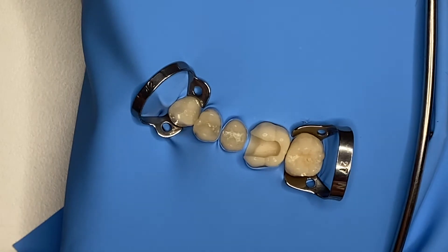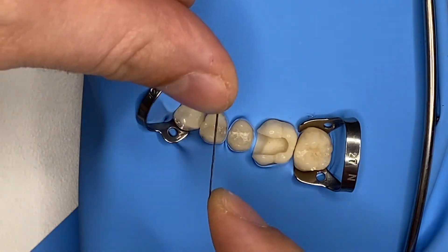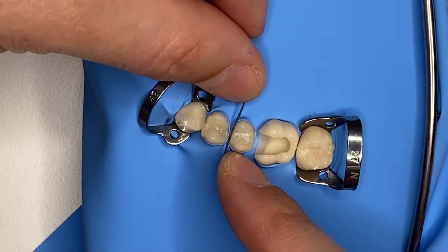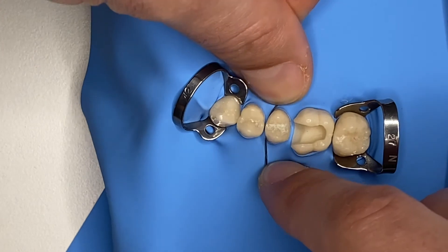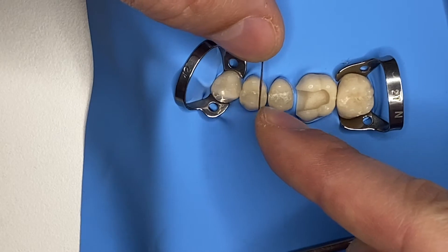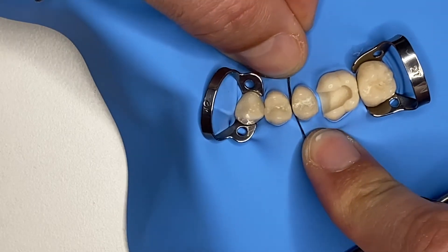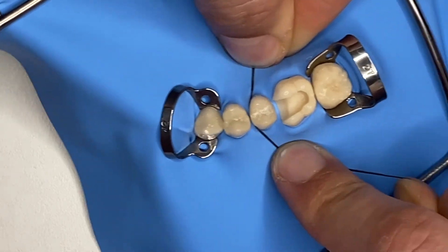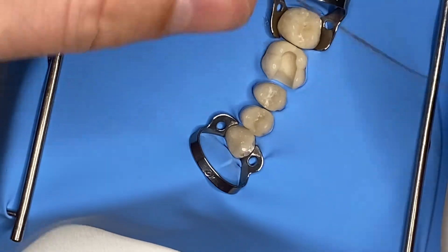For example, between my two premolars, you can see that the rubber dam is caught — this is a thick rubber dam. What I'd like to do is to use my floss in such a manner which allows me not to cut the rubber dam. How I do this is quite easy: I choose a wall of the tooth that I'm going to follow, and using this C-shape of the floss, I only touch that wall.